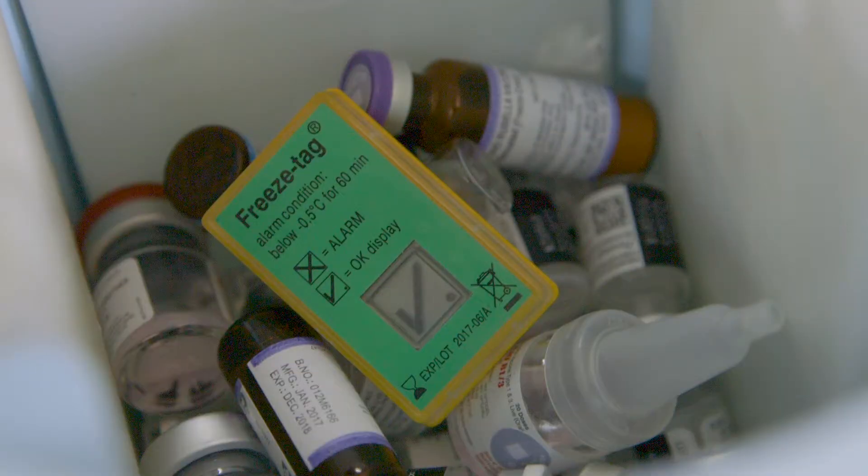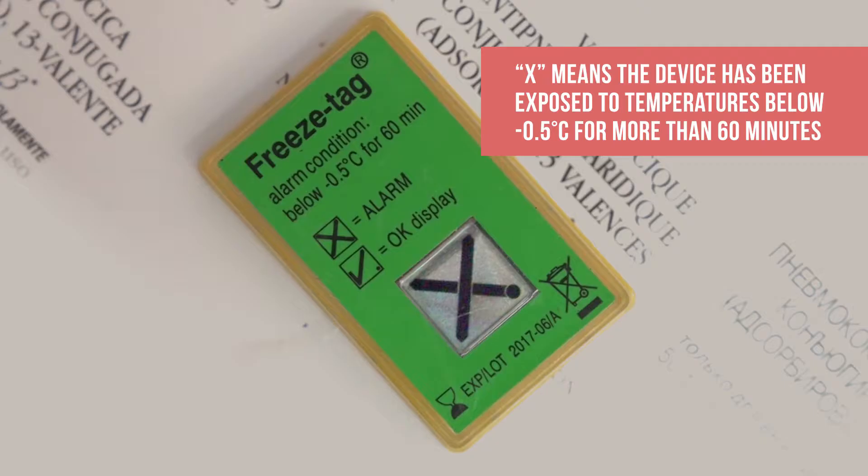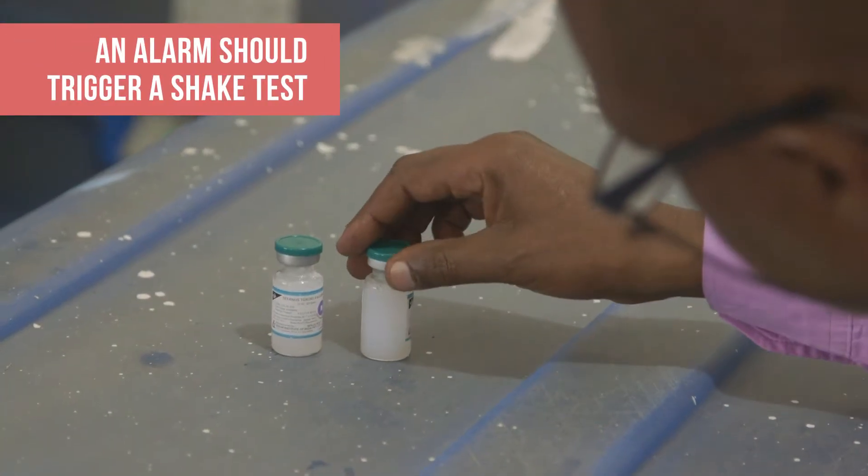An electronic freeze indicator has a visual indicator that shows whether the vaccine has been exposed to freezing temperatures. A check mark shows that the temperatures are OK. If it shows an X, the device has been exposed to a temperature of negative 0.5 degrees Celsius or below for more than 60 minutes. The X signifies an alarm.